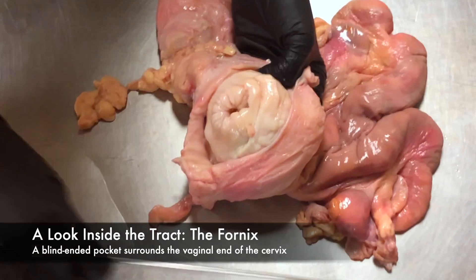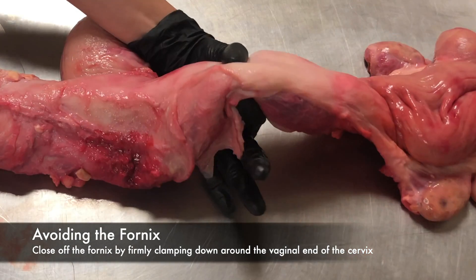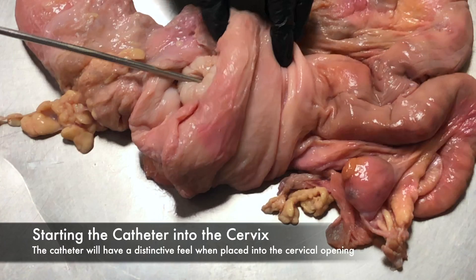The fornix tends to stretch, so the catheter could appear to be advancing forward, but really could be above, below, or to the side of the cervix. Clamping down around the vaginal end of the cervix, you can close out the fornix and guide the AI gun straight to the entrance of the cervix. You will feel a scratching or dragging sensation to the catheter once the tip is at the entrance to the cervix.